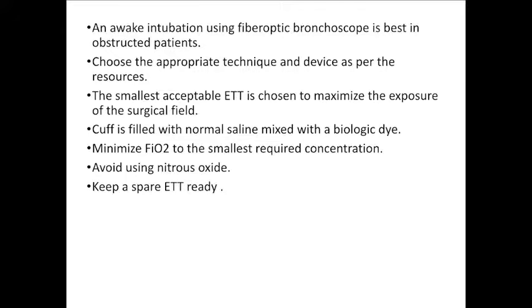In a patient with a compromised airway, an experienced anesthetist and surgeon should plan the technique to secure the airway based on the result of video laryngoscopy, which should be done prior to the procedure. In awake patients, fiber optic is best in case of obstructions.